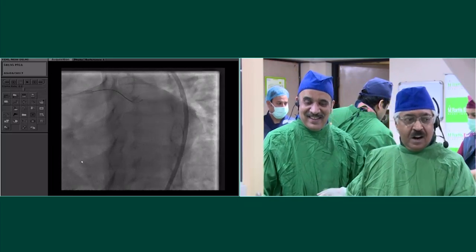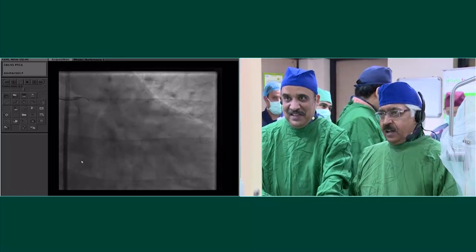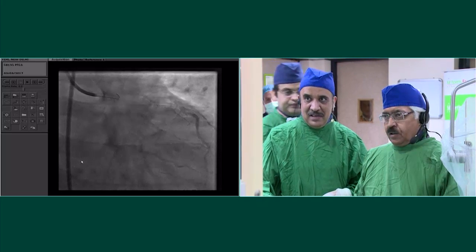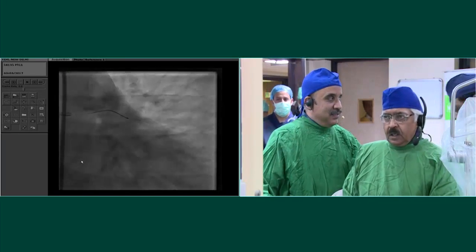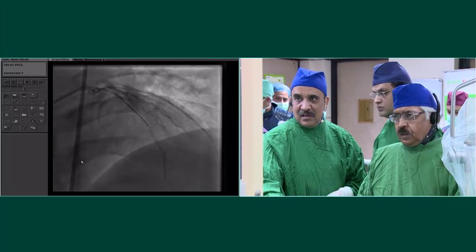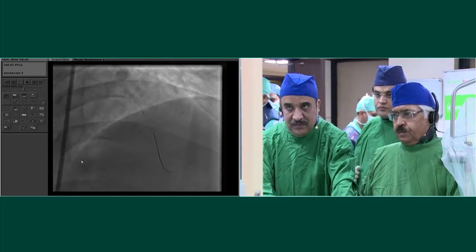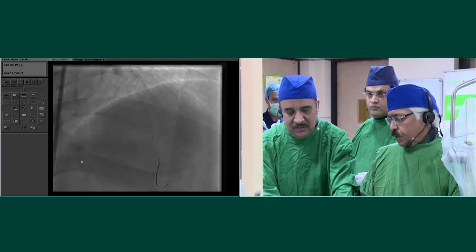Okay, so let's come out. We could always come back. This is cranial. I think yeah, so let's get into the LAD first. Okay, let's go cranial, and let's have a cutting balloon, which could be a 3.5, a Flextome. Show me, Vijay. Okay, so the wire's there, and let's have a Flextome.